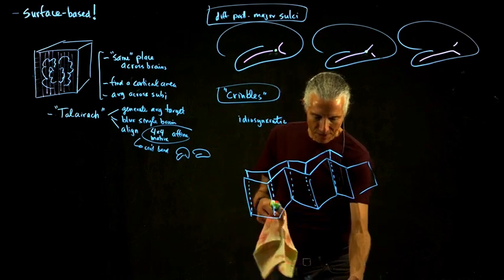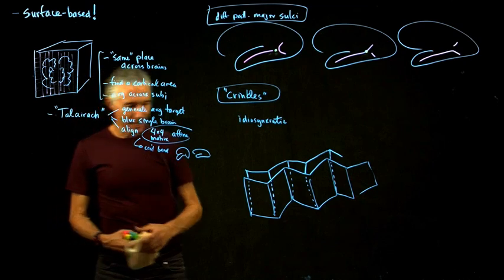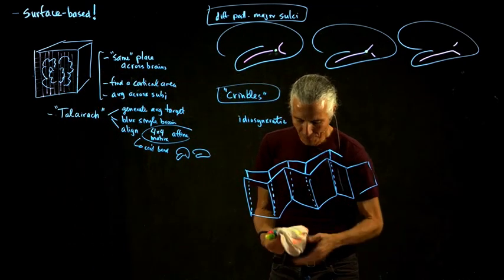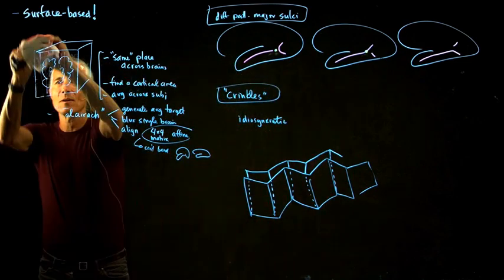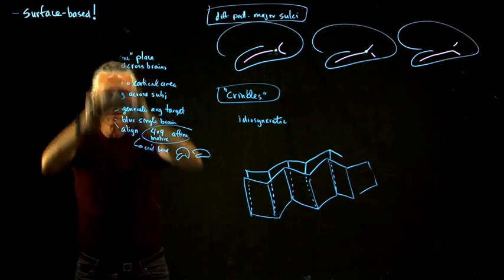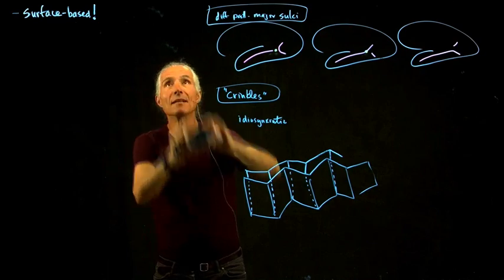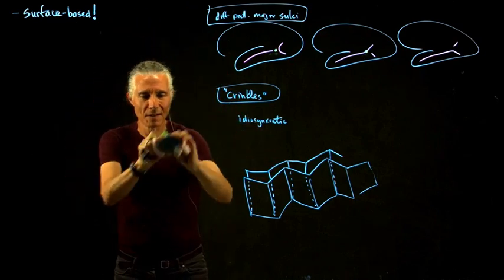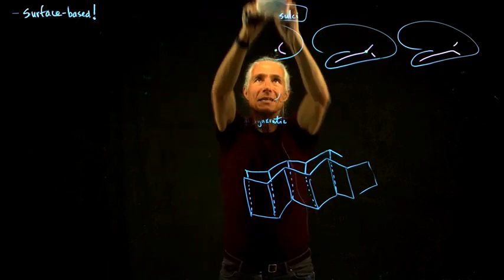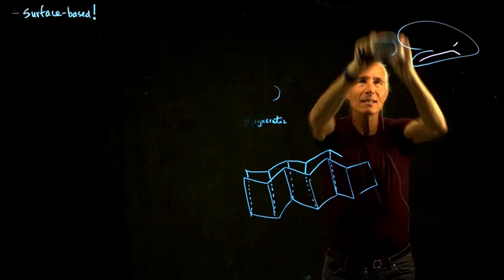And it's really an obvious thing to do. There was a lot of resistance to it over many years because there's a little more work to doing it. But my entry into it was in the days before high-resolution MRI images were available, and I had done neurophysiological work where I would just physically flatten the cortex.